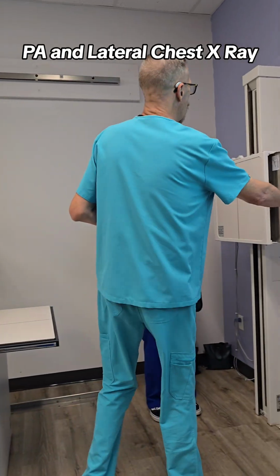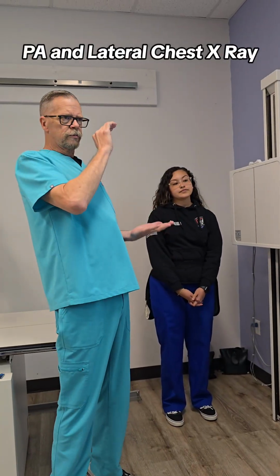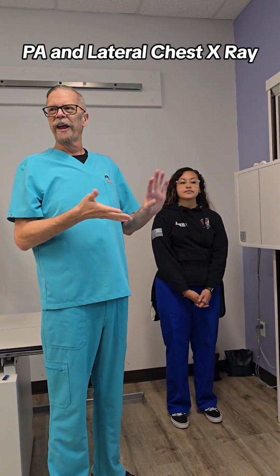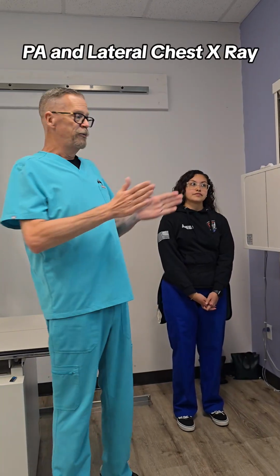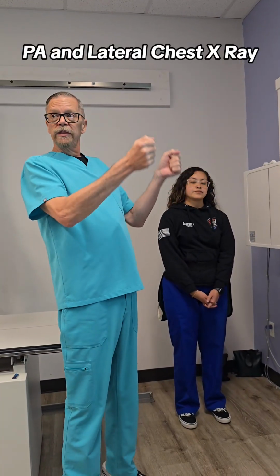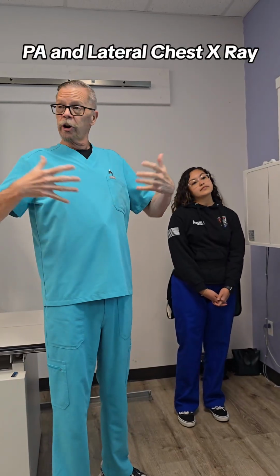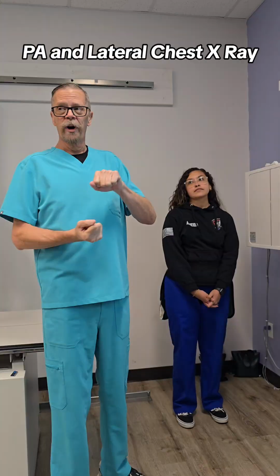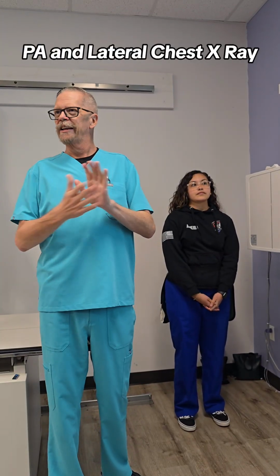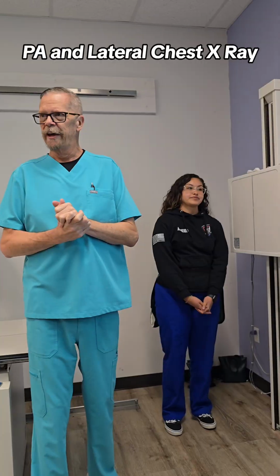So, again, your image receptor, lengthwise or crosswise, portrait or landscape, is based on the body habitus of your patient. If everything can fit lengthwise, that's how I prefer to do it. Some of your patients are going to be larger, and you're going to have to do it landscape or crosswise. I still can't get portrait and landscape straight.